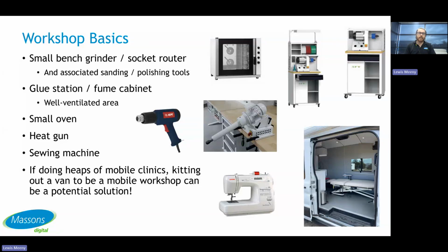Ideally, a glue station / fume cabinet, if you can get one that works as both, great. In a well-ventilated area if possible, because you will likely need to be using some glue. Same small oven and heat gun for heating adjustments, and if you can fit one in, of course, a little sewing machine is going to do you wonders.